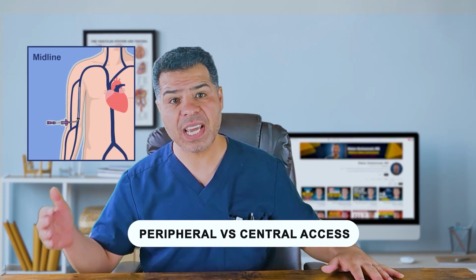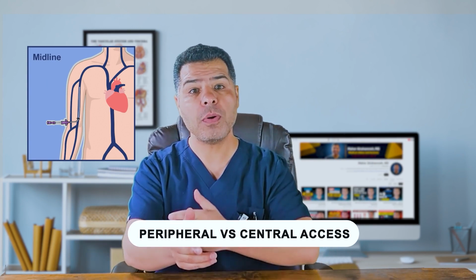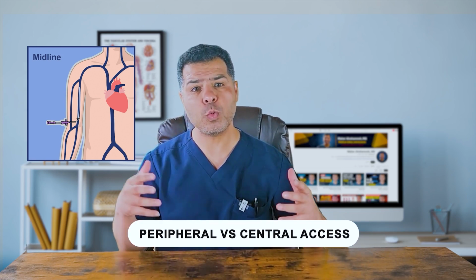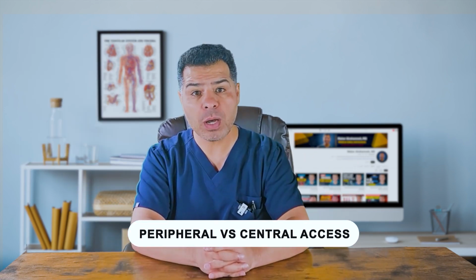These are longer catheters, usually 8 to 20 centimeters, inserted into the upper arm veins. They do not reach central circulation but provide more durable access for 1 to 2 weeks and sometimes up to 4 weeks or 30 days if monitored closely.